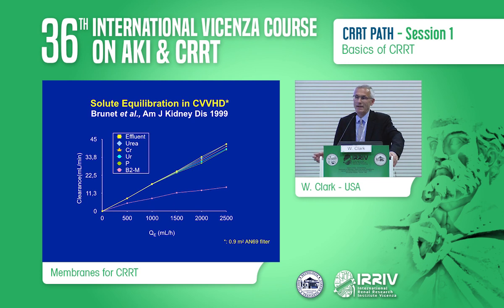And in fact, in CRRT therapies, if we specifically focus on diffusive therapies, CVVHD, it's a completely different mindset compared to the considerations that we talked about for chronic hemodialysis and minimizing diffusive mass transfer resistances. In CVVHD, this is an older slide, and we'll talk about newer considerations in a second.